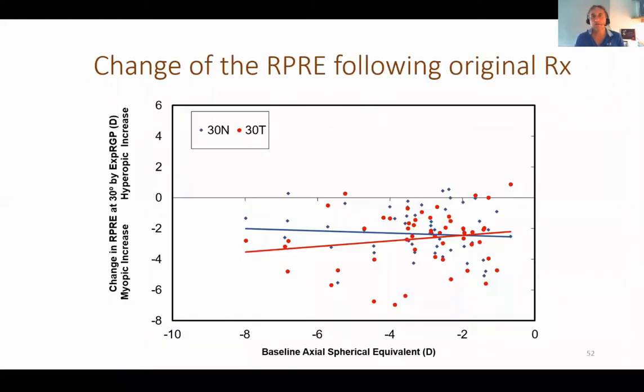The beauty of the contact lenses that we are talking about today is that they are daily contact lenses, so the lenses that are worn during the day. Last time we discussed ortho-K. Ortho-K lenses are used during the night. The daily wear lenses have a different system for myopia control. They are an additive technique. So we change the shape of the optical surface, and we change the image shell however we want, because we can add the shapes we want on the front surface of the lens. And this is the beauty, because we can make the same difference all along.